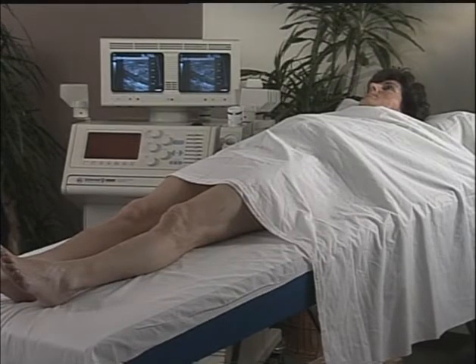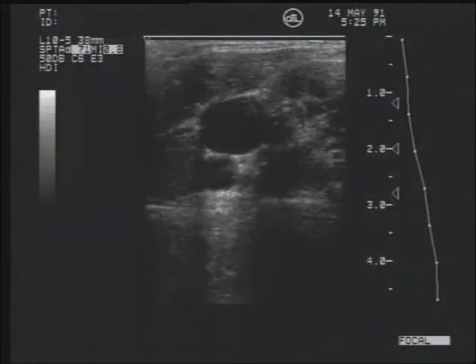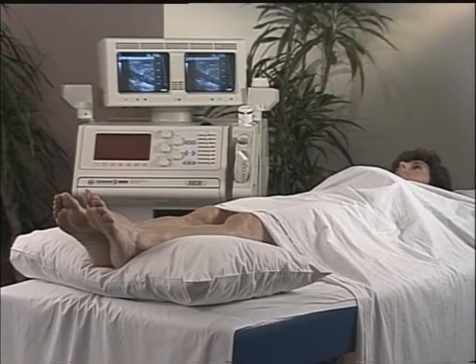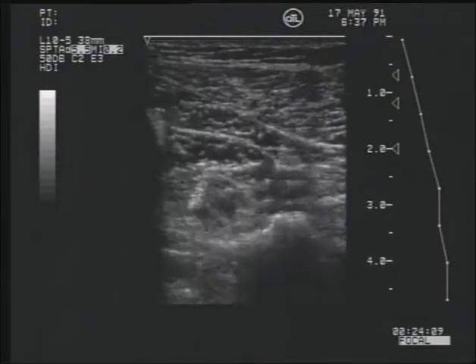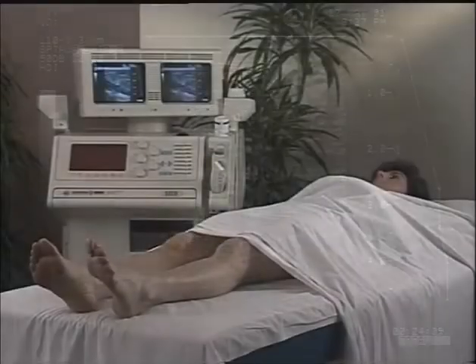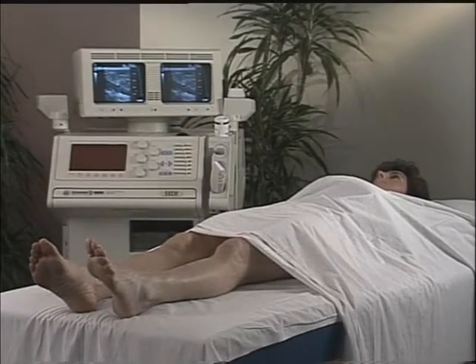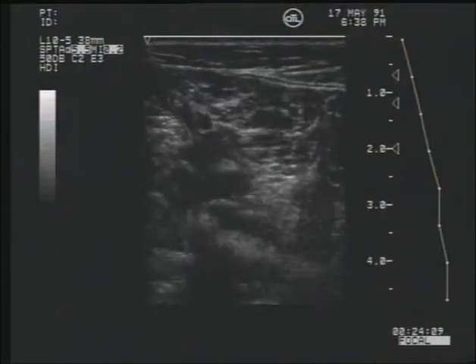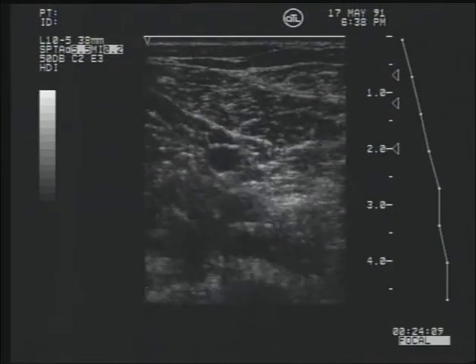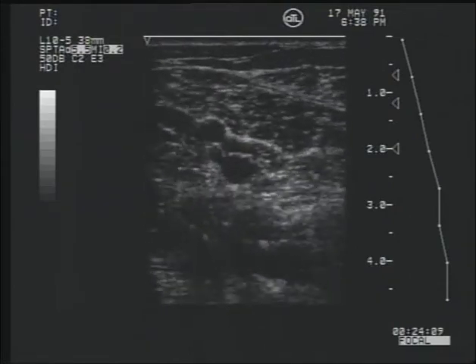The extremity being examined must be below the level of the heart in order to fill the vein with blood well enough to visualize it as a round, fluid-filled structure. Elevating the extremity above the heart causes blood to empty from the venous system, permitting the vessel to collapse. This may make the vein difficult or impossible to identify during the ultrasonographic examination. Positioning the extremity at the level of the heart usually allows visualization of the vein as a partially filled, elliptical-shaped structure, which is less than optimal for clear ultrasonographic imaging.